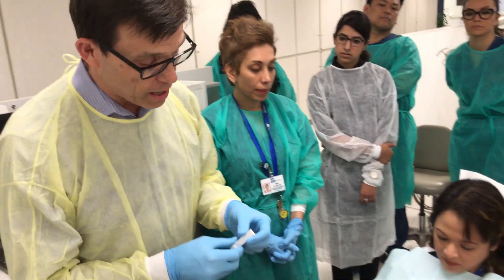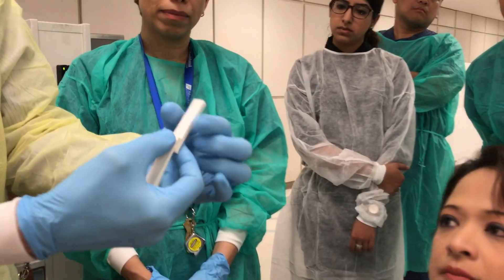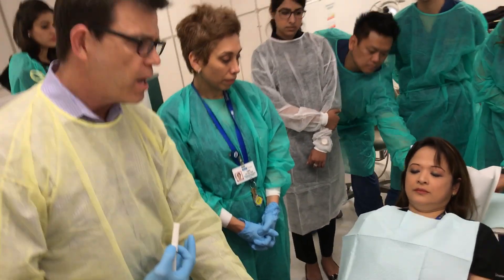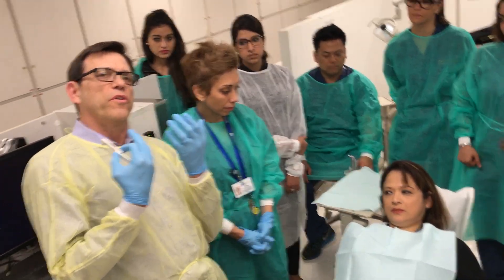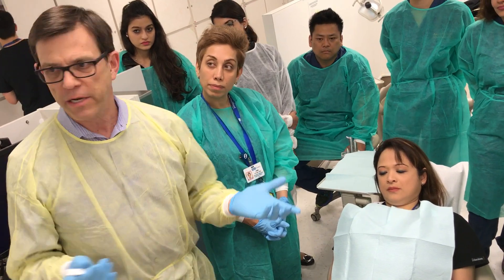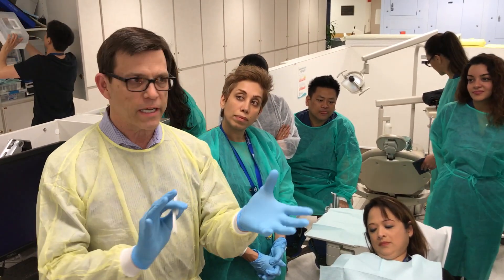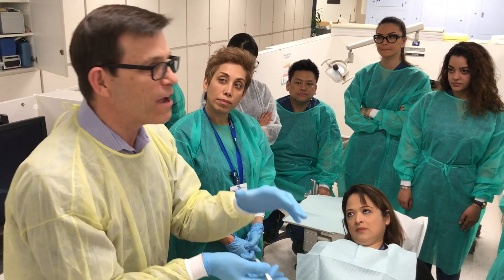So let's go ahead on a deprogrammed patient without any muscle soreness or pain. Go ahead and take away that first stack of leaves. Now I've cut my leaves in half and my patient's comfortable. Some dentists like to have the patients leaning back a little bit further. They believe it may be easier because gravity is helping to hold the jaw back. But really you can get centric relation with your patients sitting upright, laying back, in any way you like. It's a position that is not spatially alterable — it's an actual position in three-dimensional space.